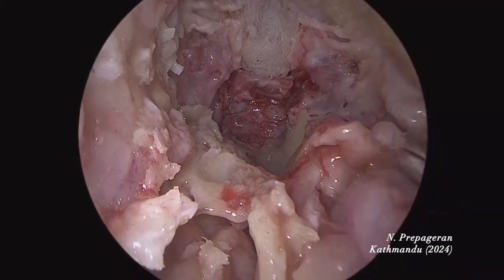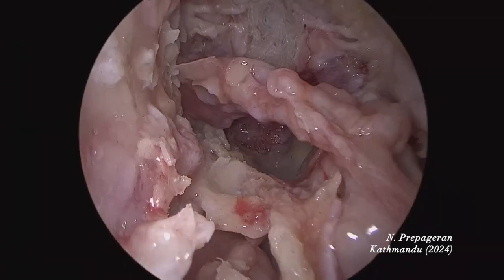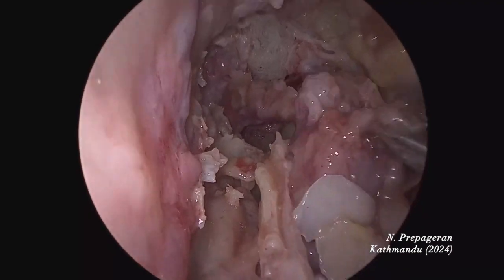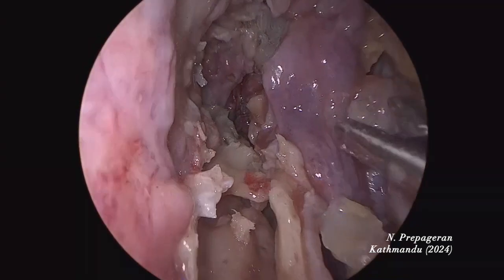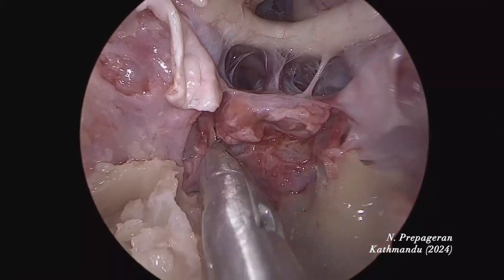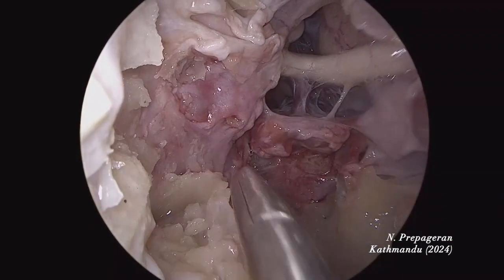Once the dura is all placed back, apply tissue glue. Where is our septal flap? Our Hadad flap — that's the Hadad flap down here. The septal flap goes and covers the whole area. This is the carotid exposed here — that's the paraclival carotid. It comes from here and then forms a siphon. I'm going to cut the dura so you can see the entire carotid. Now it's clear.